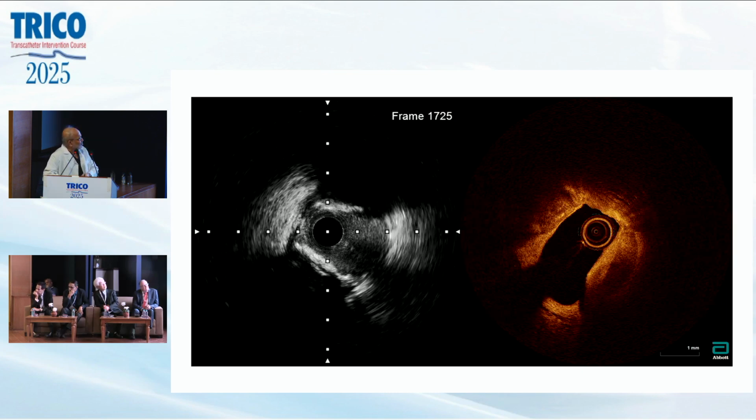This is malignant, ugly calcium. Two sides, one is nodular calcium getting into a calcific nodule, and another side is the calcium nodule. You should have luck to give a good minimal stent area in this case, or else you keep an under-expanded stent. What do you think, Professor Akasaka?